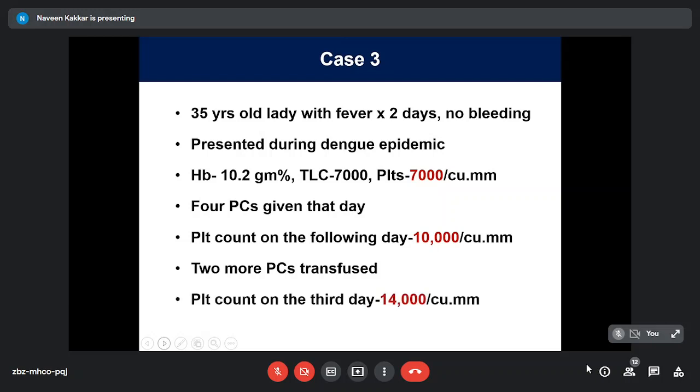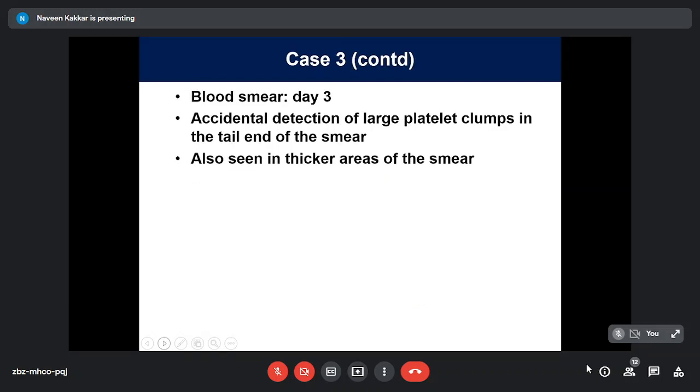Third day, still low. But on the third day, one of our senior residents brought the smear saying that there are large platelet clumps. So there was an accidental detection of large platelet clumps in the tail end of the smear. This was also seen in the thicker areas of the smear. We looked at the smears of the first 2 days. They had the same clumps that were actually missed, because in the dengue epidemic, everybody was sitting with piles and piles of platelet counts. All they did was put a drop of oil, see no platelets or low platelets, and reconfirm the automated count. That is what happened. So on the third day, luckily, somebody saw this probably at scanner or low power and brought it to our notice.